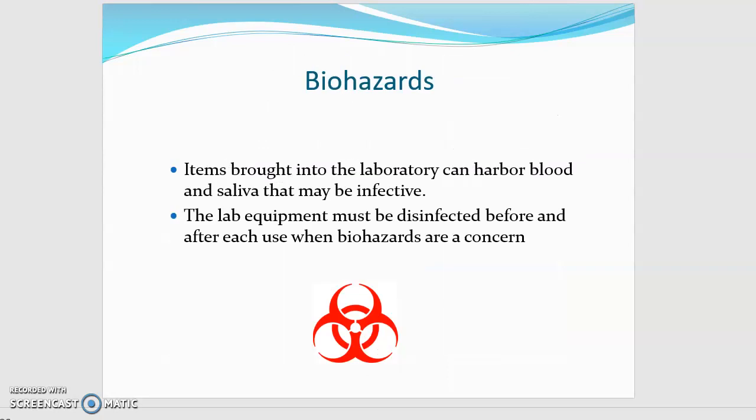There's of course biohazards present because anything that's brought into the lab could harbor blood, saliva, or other infectious materials. So we need to make sure that we disinfect our lab equipment and whatever prosthetic or removable item that we're working on.